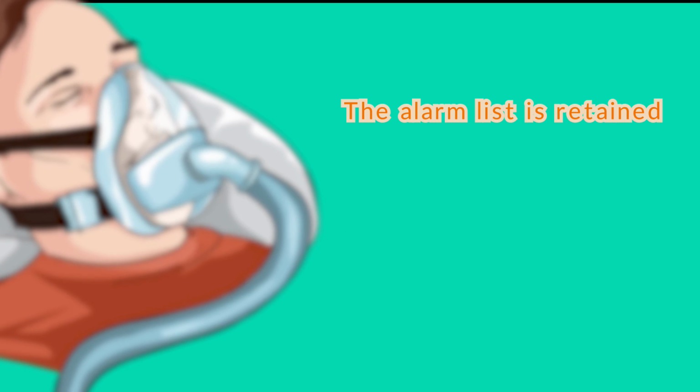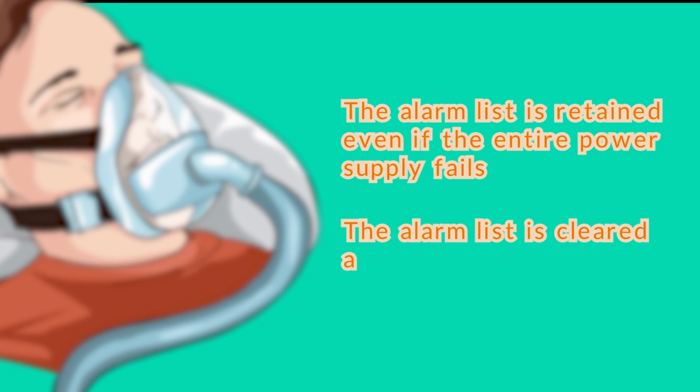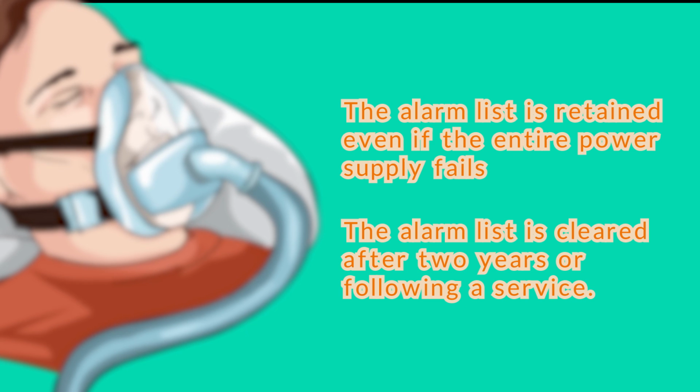The alarm list is retained even if the entire power supply fails. In this case, the data can be called up for up to 2 years. The alarm list is cleared after 2 years or following a service. A maximum of 100 alarms is stored and displayed, after which the oldest alarms in each case are overwritten.